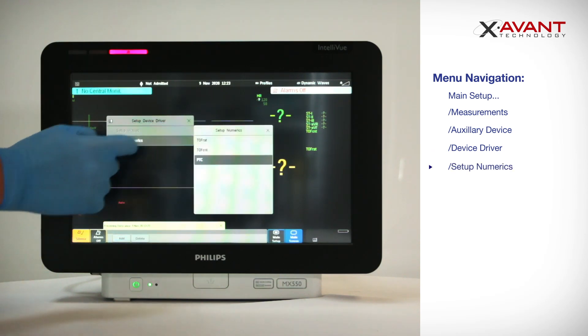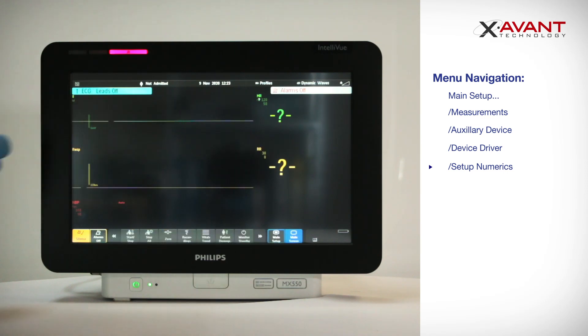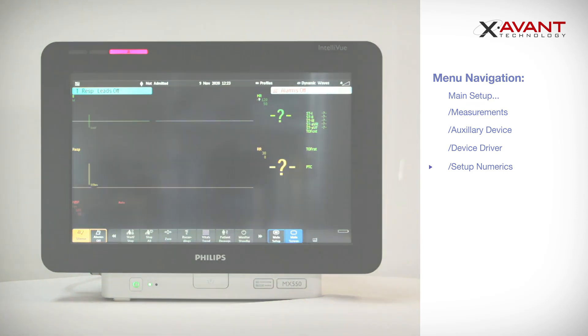Once you are complete, you can close all open windows by selecting Main Screen, or closing the windows individually, and the new measurements will now be displayed on the monitor.